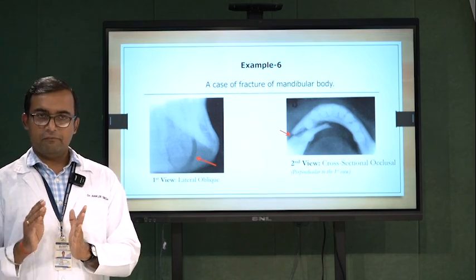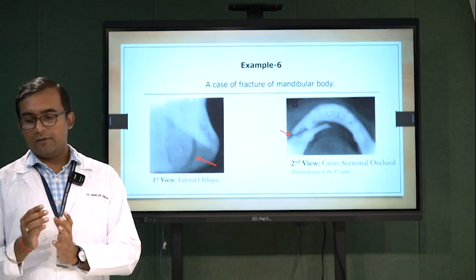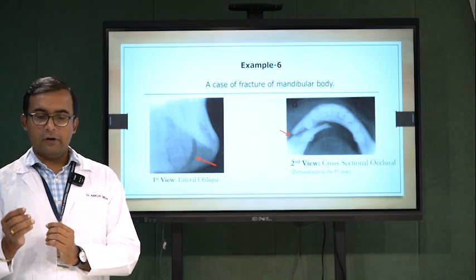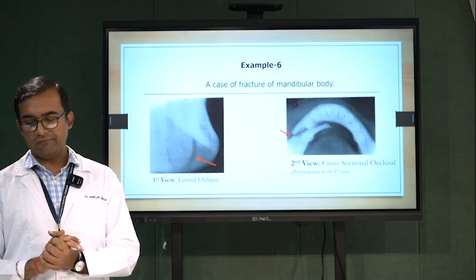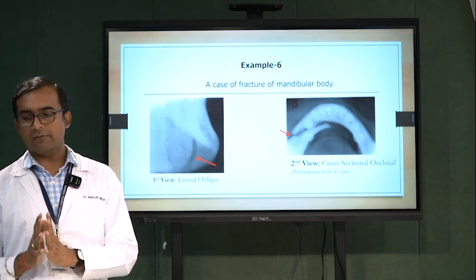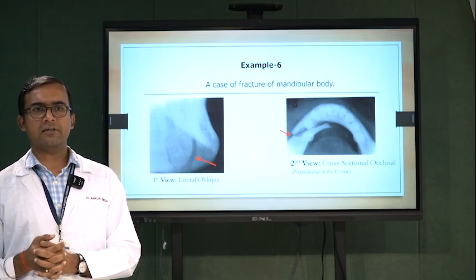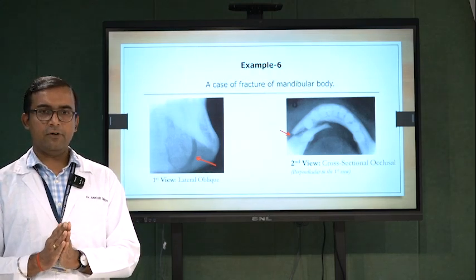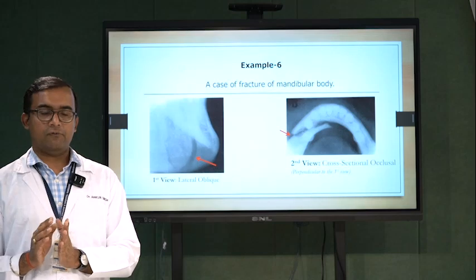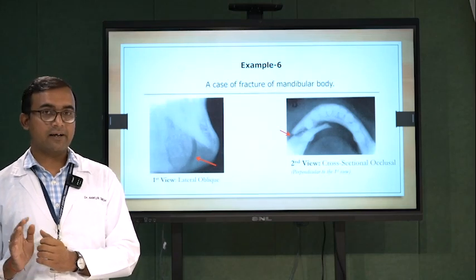How one radiograph shows it is a favorable fracture, whereas the other one shows it is an unfavorable fracture. So all the three dimensions are important whenever we want to make a judgment of which technique we want to perform to treat a case.